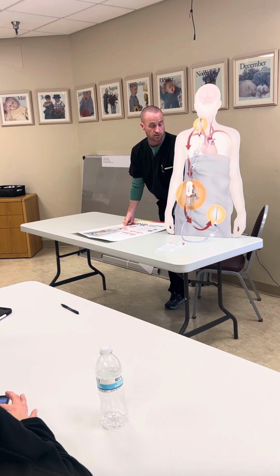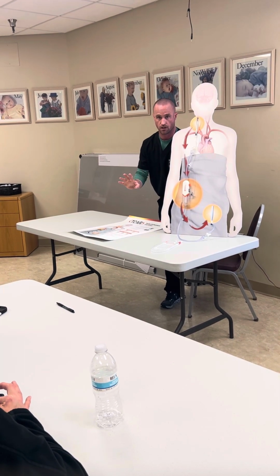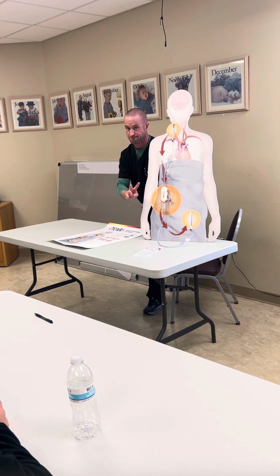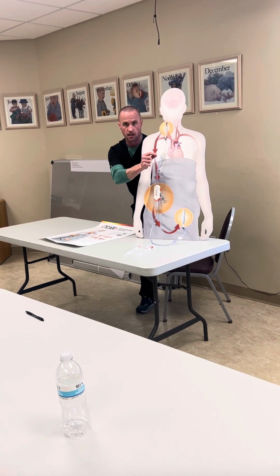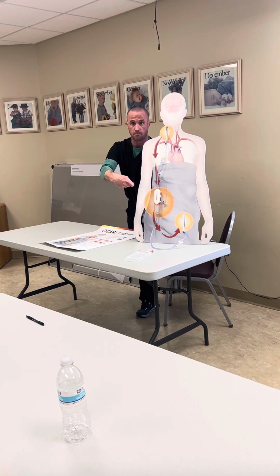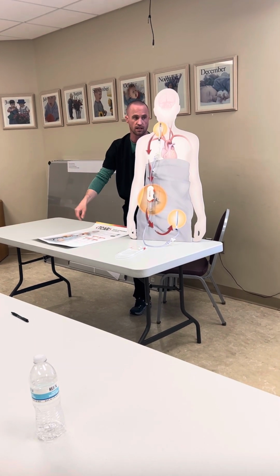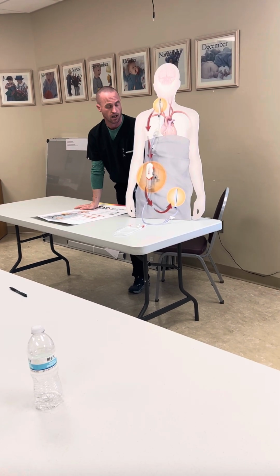And you'll hear us sometimes, I don't know, will we have a first assist with us on every case or no? Just a surgical tech? 2 surgical techs? Possibly. Yeah, that's ideal, because when he's doing his cut down, and of course the arterial sheath insertion, someone up top can help him with that, while someone else is on the back table, prepping the stent, handing off wires. If you had one person, that's the hardest part, being in 2 places at the same time.